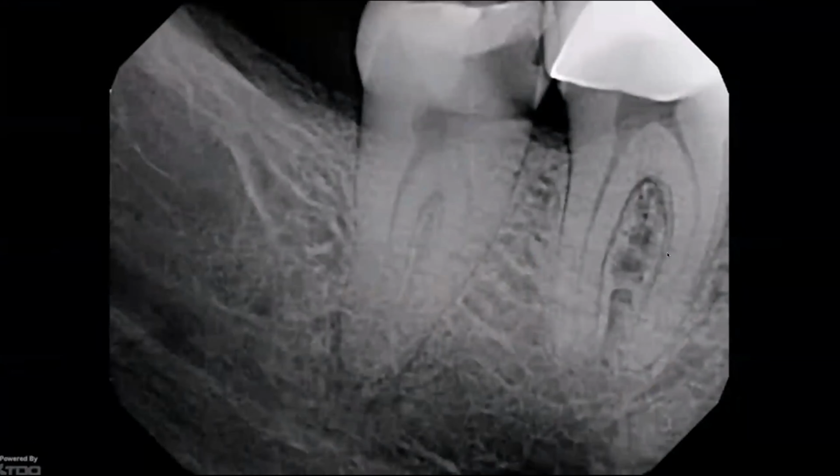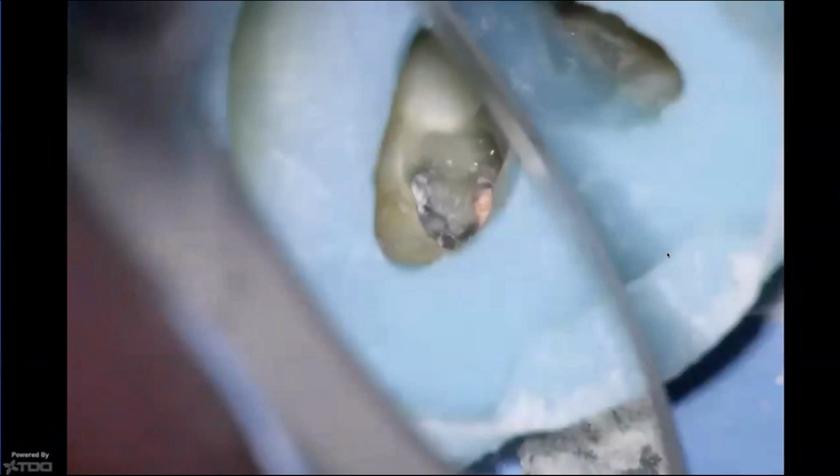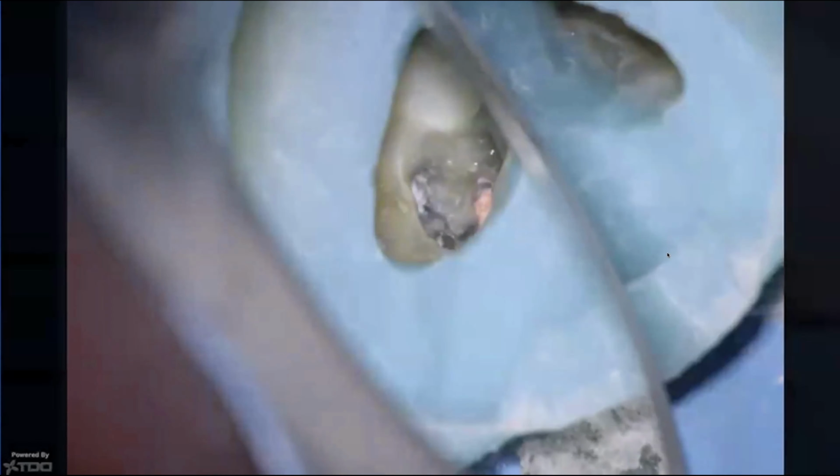So this is a perfect example. We have a C-shaped anatomy. This is after having run Gentlewave, after having done the obturation through the platform. I cut back in order to create that casing, and then that casing will be able to encompass all of the dual cure composite resin that's then placed inside. Afterwards, the beautiful thing is you can then pop off the sound seal and then refine the margin.